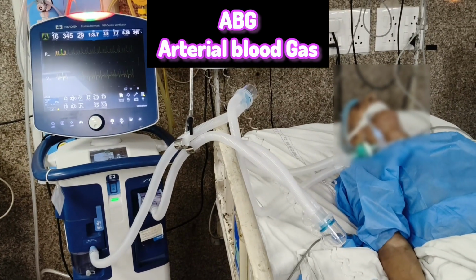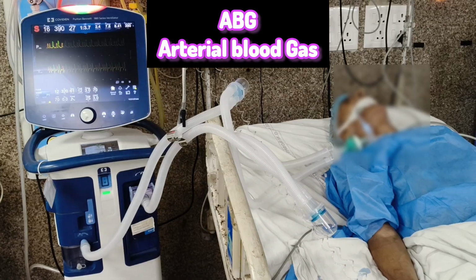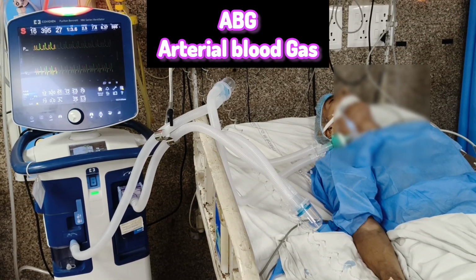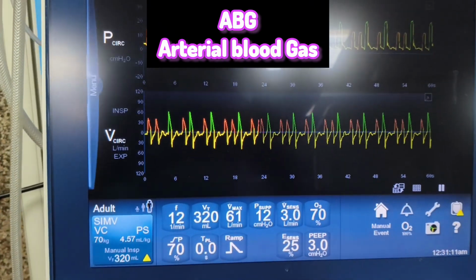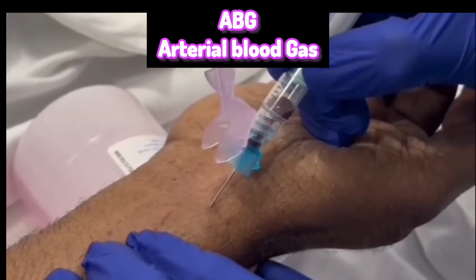ABG means arterial blood gas. It is not just a blood test. It's an emergency procedure done in ICU to save the life of a person. It tells us how well the lungs are working, how the patient is breathing, and whether the blood chemistry is normal. One small mistake in ABG sampling can lead to wrong clinical decisions.